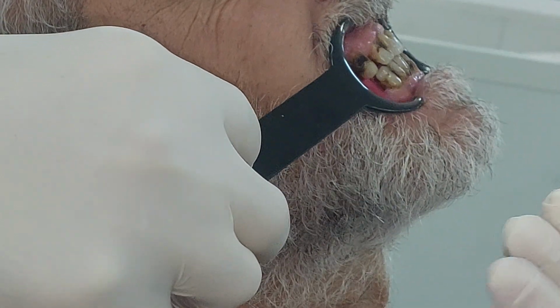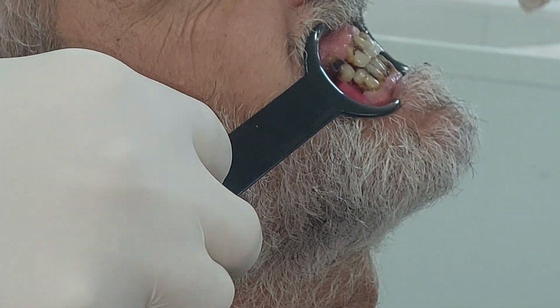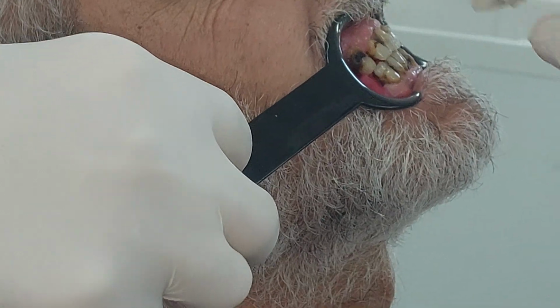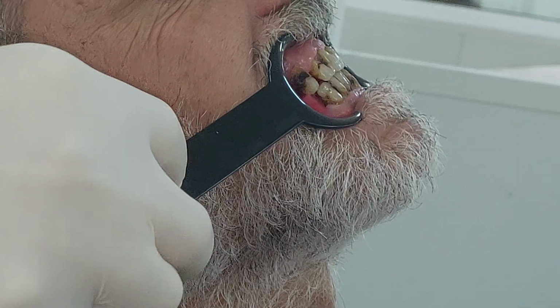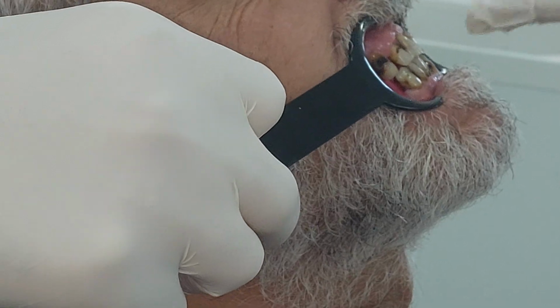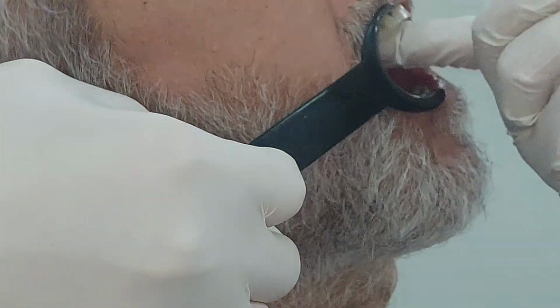First of all, I don't know the original vertical dimension. So what am I going to do? I'm going to ask you, doctor, put a dot here, and measure the resting position, the natural occlusal position, and see the difference between them and the rest position and see how much vertical dimension I could increase. So I'm going to redesign the occlusal plane. Then, after that, I'm going to remove the lower. When we do wax registrations and they are opposite to each other, we do the upper first.